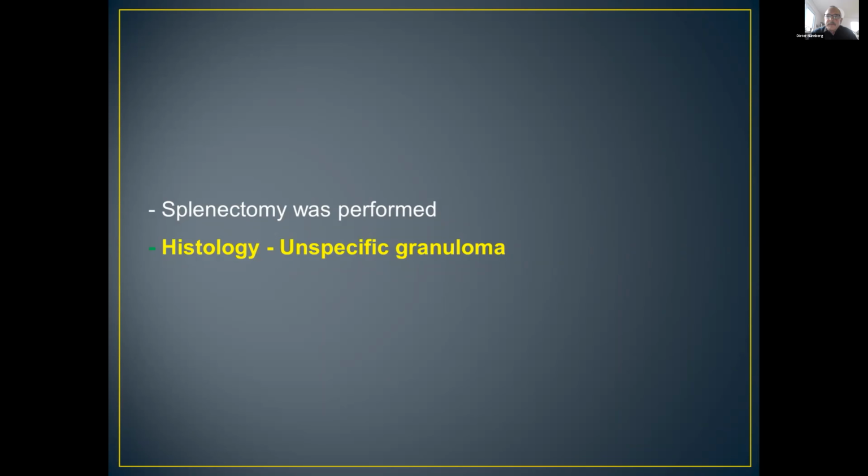Okay, you are right. In the past, the first choice was splenectomy. Today we would discuss biopsy. The risk of biopsy of the spleen is a little bit higher than biopsy of liver or other organs, but it's low. It's lower than 1%, the bleeding risk. And if the coagulation is okay, you can do it. You have to discuss it with the patient, but you can do it.